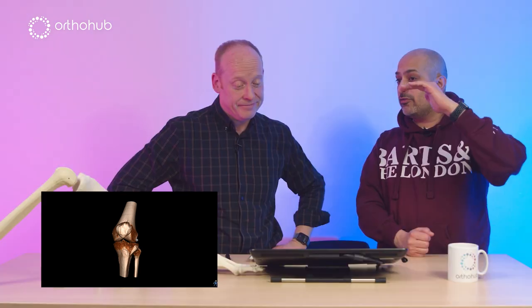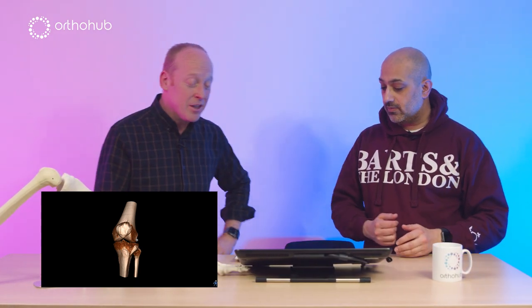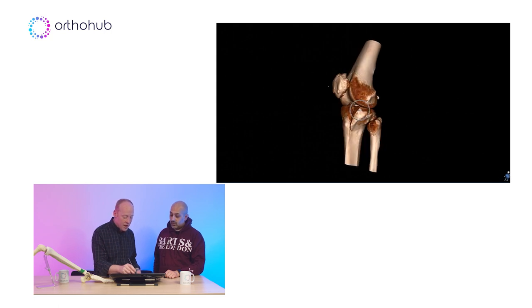And now it's from the coronal sagittal. I think it's probably because it wasn't very good when they were training. It doesn't exist. Exactly. And eventually you reach a point, look, I refuse to take on any new knowledge. These are brilliant. But the 3D recons are super helpful because you can move around them, you can subtract bits of bone, and you can really almost climb inside the fracture. And this is the same fracture, same one, and you can move them around, of course.